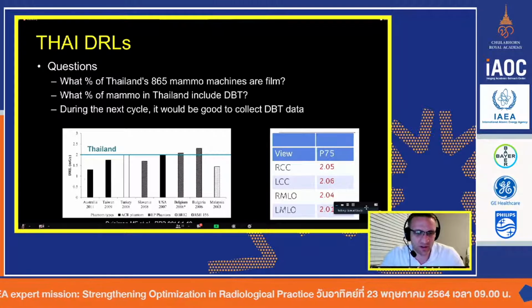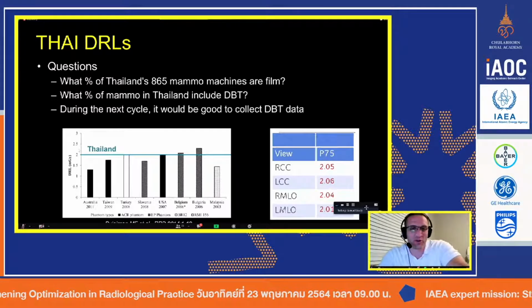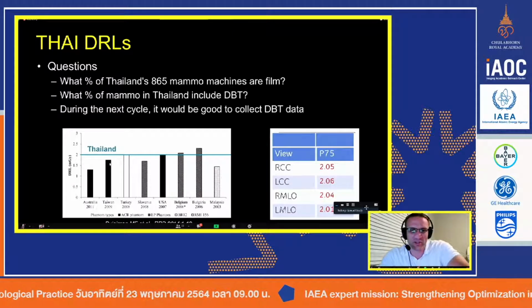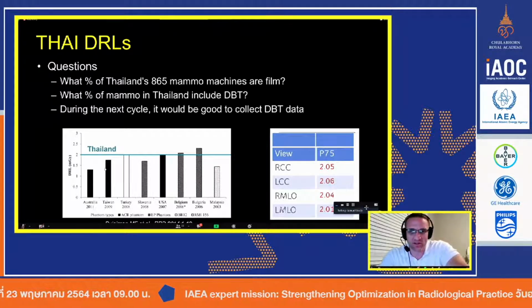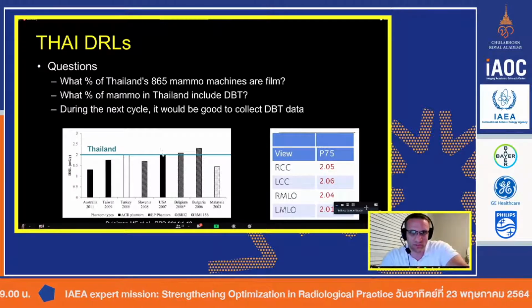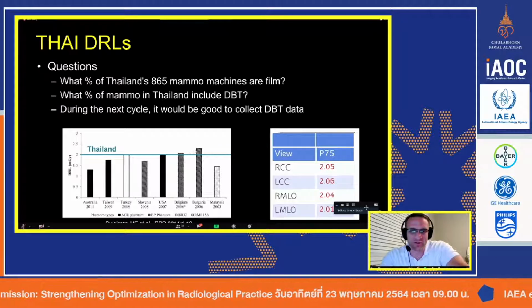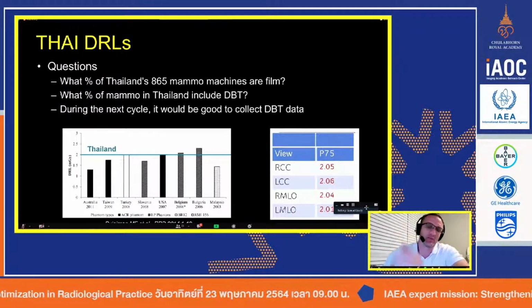They don't use a lot of radiation, or they just compress their poor women a lot. And then Taiwan's a little lower, which is comparable to you guys, just neighbor-wise and population. And obviously here, US, we kind of agree with you guys. And then some of the European Eastern Bloc countries are a little higher. So you guys are just right on. Some are a little higher, some are a little lower.